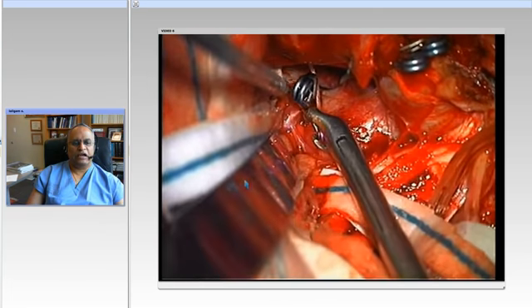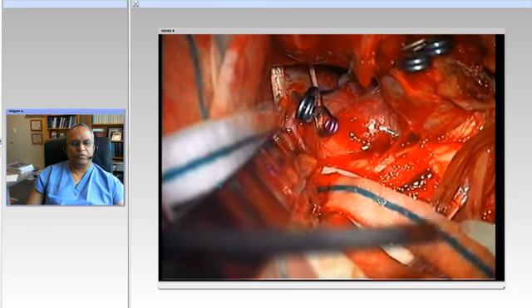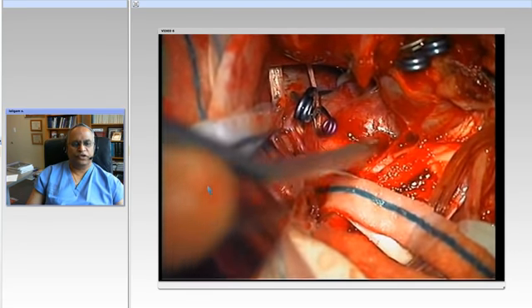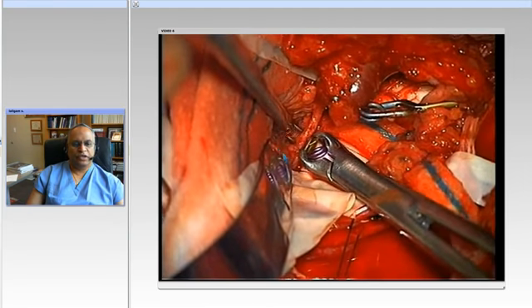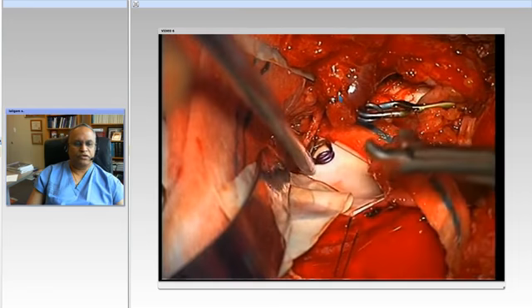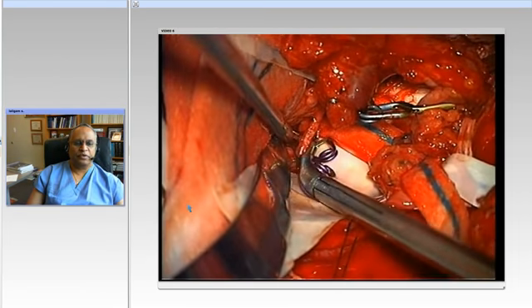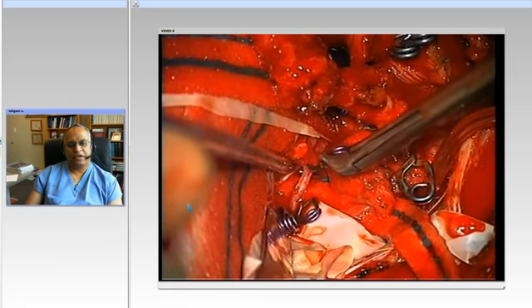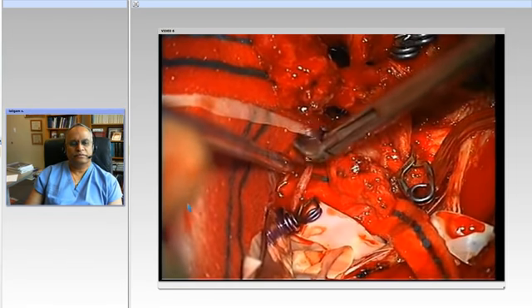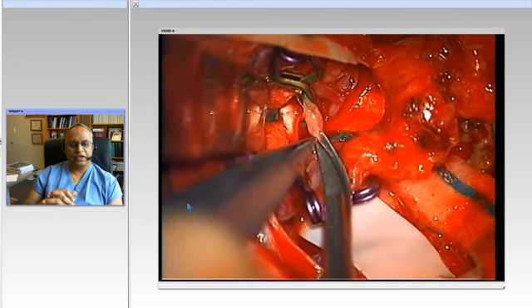Now, not only is there not much flow into the aneurysm, but also PICA has very poor flow. So we need to revascularize the PICA. So what we're going to do is to connect the occipital artery to the PICA. So here's PICA, temporary clip, another temporary, third temporary. It's at a bifurcation point essentially.